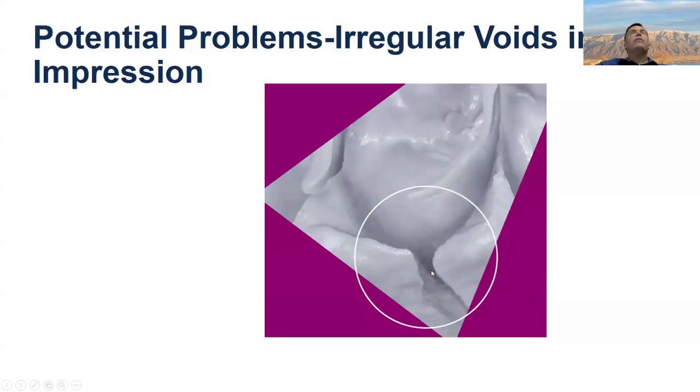If this is on the distal of number 2 and we're doing a crown on number 5 and it doesn't affect the bite, kind of who cares? I'd send it. I wouldn't take a new one. But if this is the impression of the prep on number 5, it'd probably be good to take another impression, but usually caused by setting.